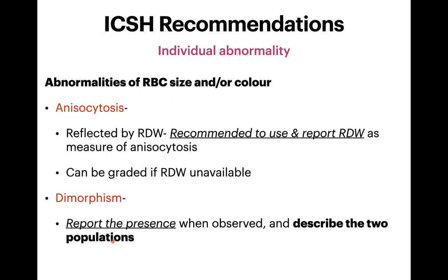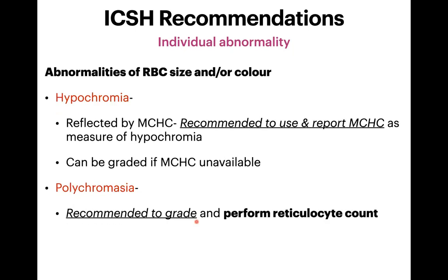Dimorphism, if it is there, report the presence and describe both populations. It is very important that you describe both populations. Don't just write dimorphic population, describe both of them. Then hypochromia, again, it's preferable to use MCHC. But if MCHC is unavailable, then you can grade it.